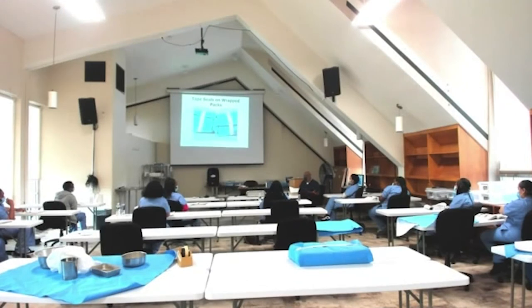So here's what happened. Shalia pushed it in, right? But she never started it. She pushed it in, and then she started doing something else, and she never hit the start button. And she went on break. Cece comes up, opens it, pulls it out, says, oh, they changed colors because they were in the sterilizer. They were exposed to the heat, right? But until you open it up and see that chemical indicator, that's one way.